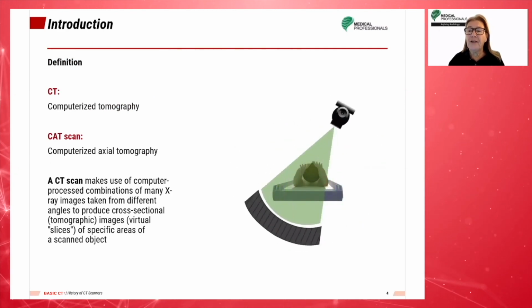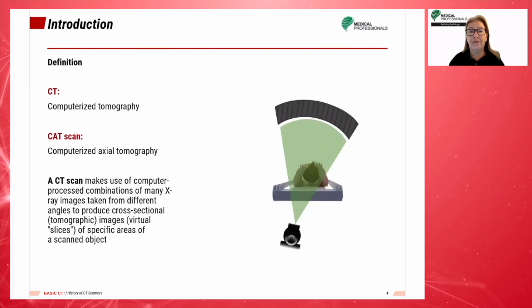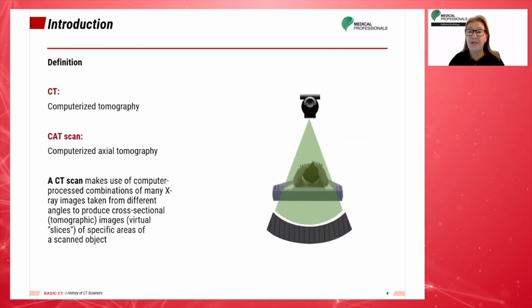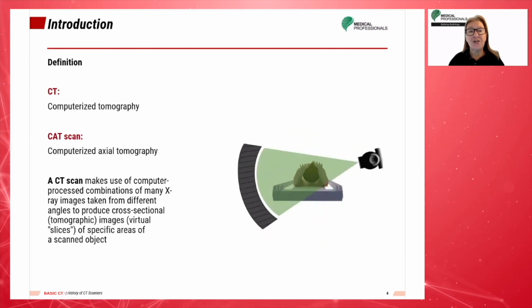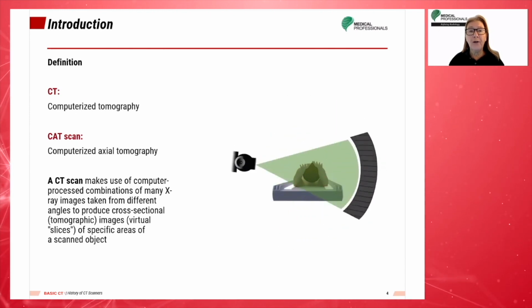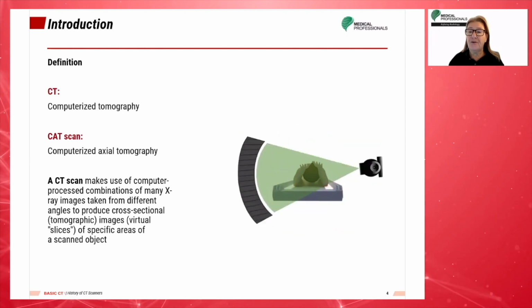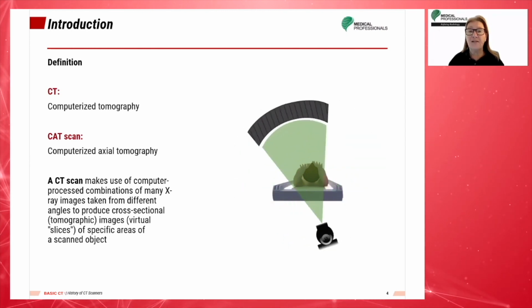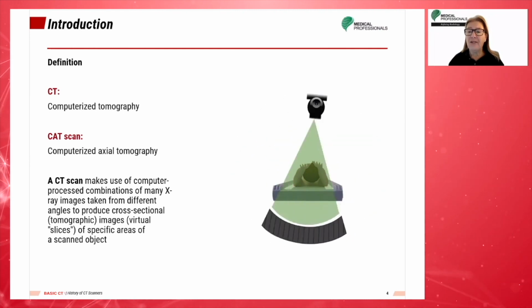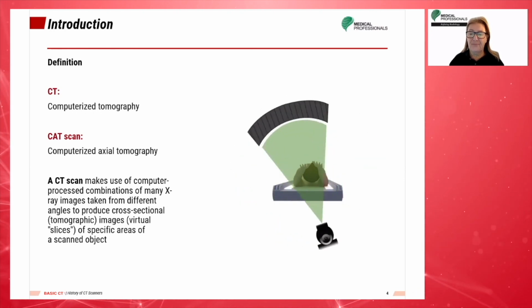Computed tomography is one of the most important diagnostic tools of the 21st century. While this tool requires competent operators, each subsequent technological generation has required the technologist to be even more highly efficient. This module will discuss the evolution of the CT scanner and explain how these advancements have changed the process of CT.